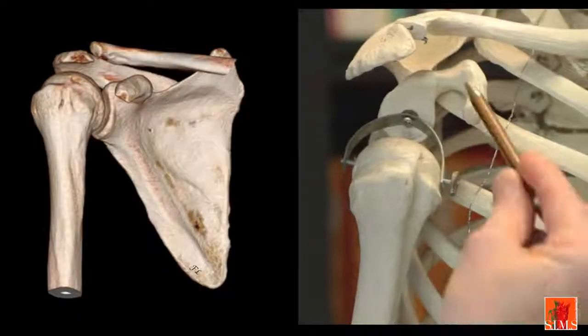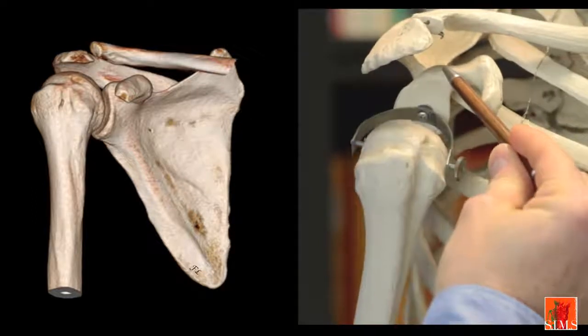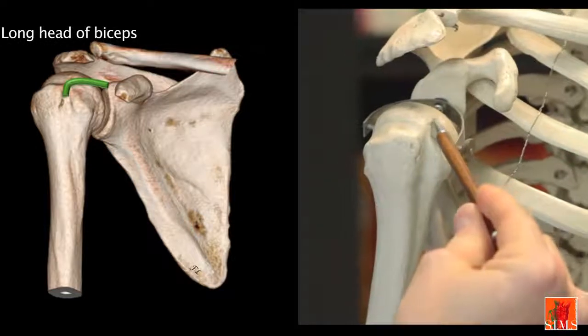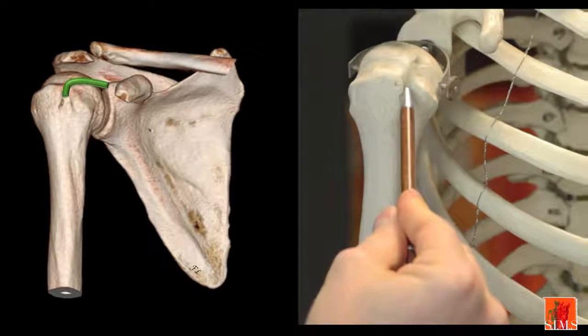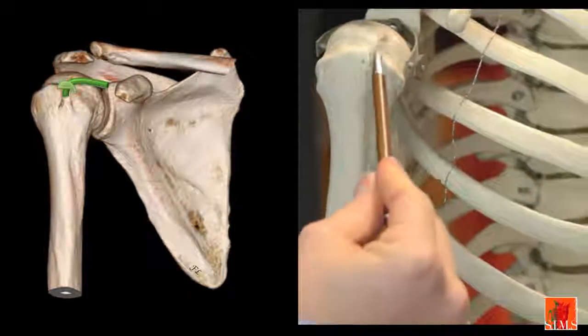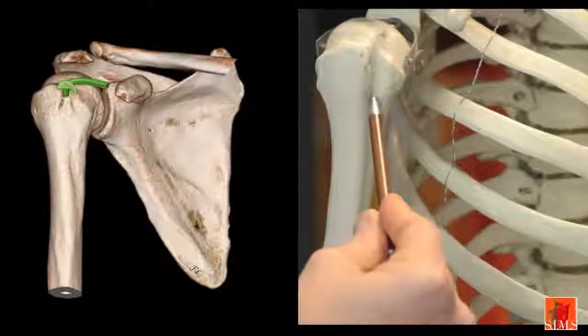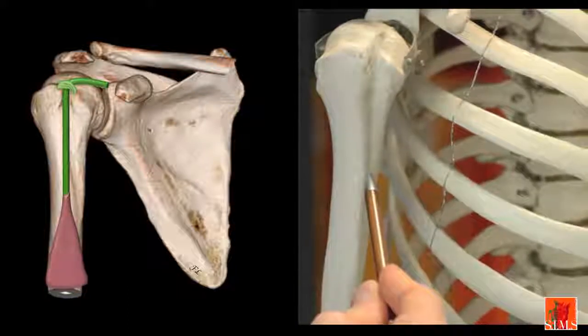The long biceps tendon originates from the supraglenoid tubercle on the upper rim of the glenoid fossa of the scapula. Its course is horizontal, here in contact with the head of the humerus. In the upper part of the intertubercular groove or bicipital groove, it then makes a 90-degree angle, held in place by the retinacular pulley or biceps pulley. Its course will then be vertical. More or less at this level we will come across the myotendinous junction.